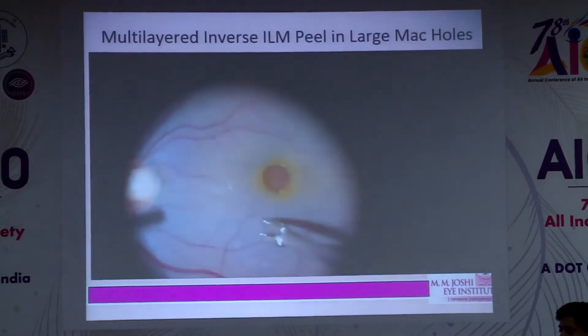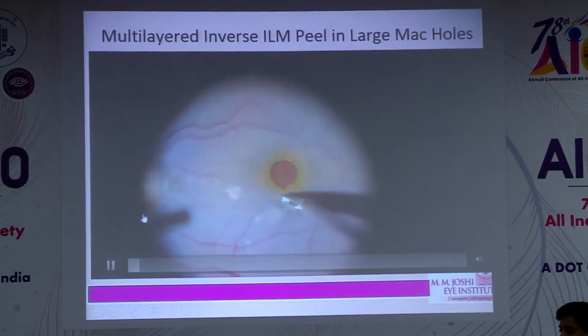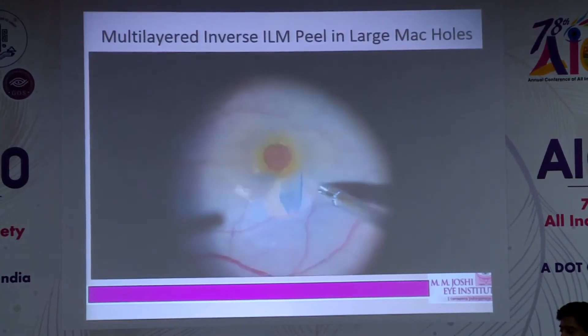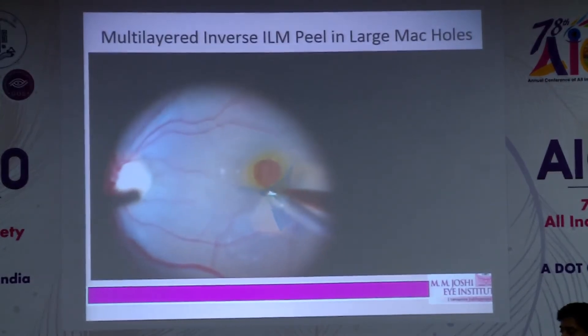I'd like to show this video of how we do it — after doing a complete vitrectomy and PVD induction. You can see that the ILM, stained earlier with BBG, is being peeled in a small petaloid fashion.